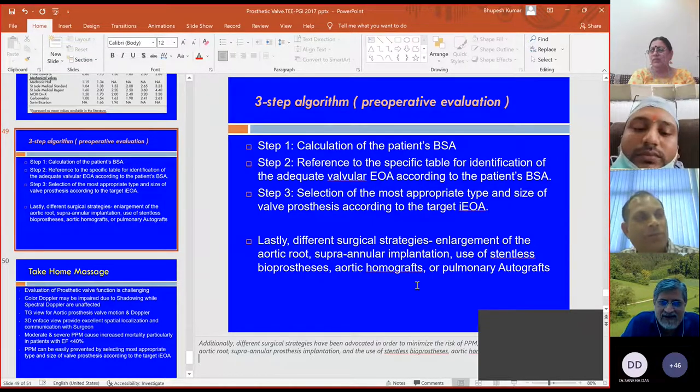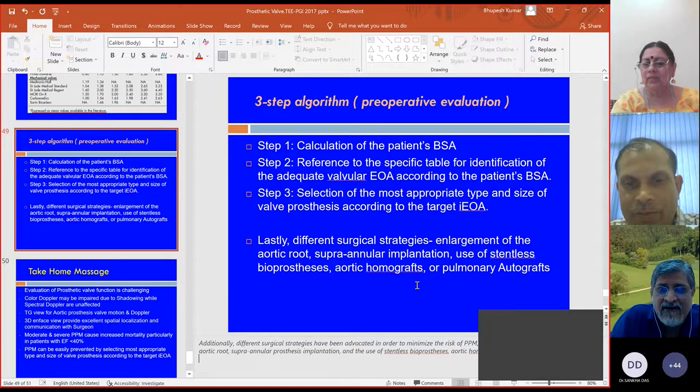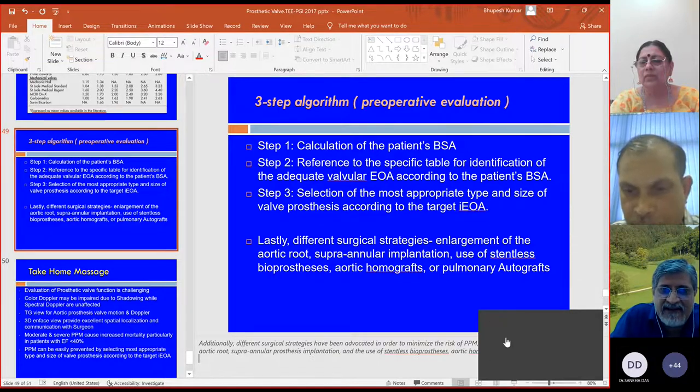Of course, with this plus minus one, this view will be useful if you want to locate the exact site of the paravalvular lesion. Sometimes the surgeons may have difficulty in identifying the leak after giving cardioplegia. So we can help the surgeon. We can show the surgeon the exact site of the paravalvular lesion. Many times surgeons themselves will have an idea, that they have put the stitches across the calcific areas, or they will have some idea where exactly the site of the lesion may be. So we can actually show the image to him.